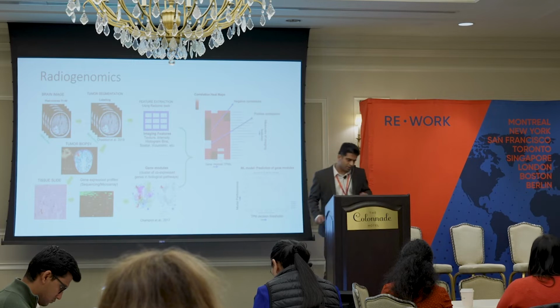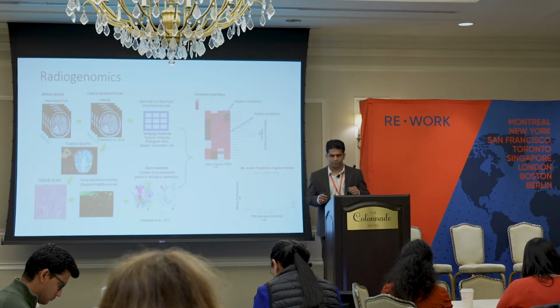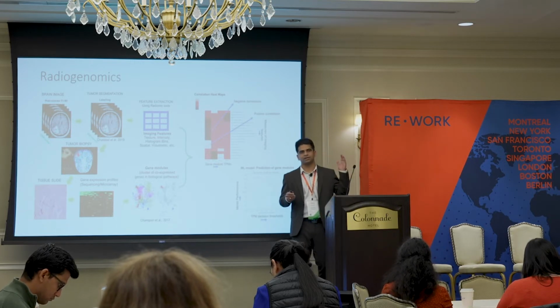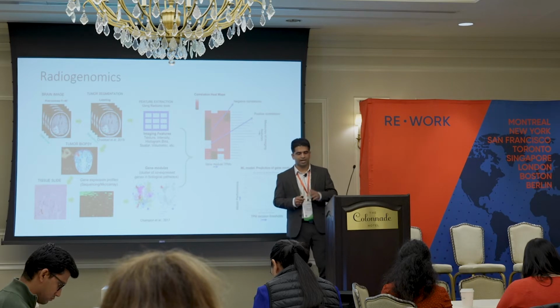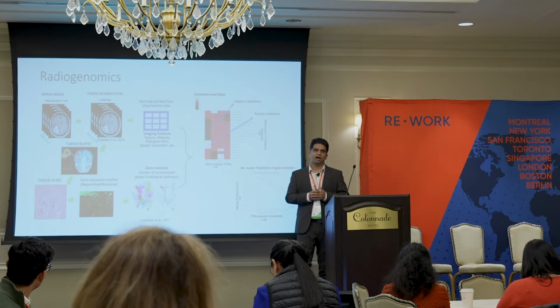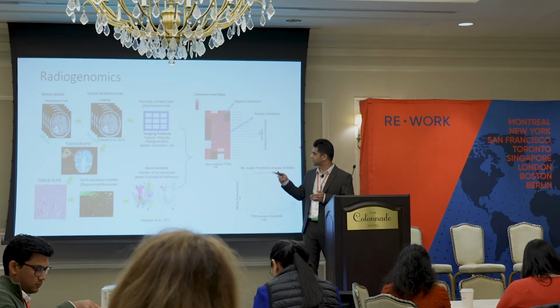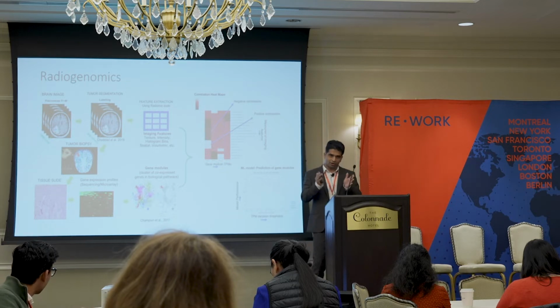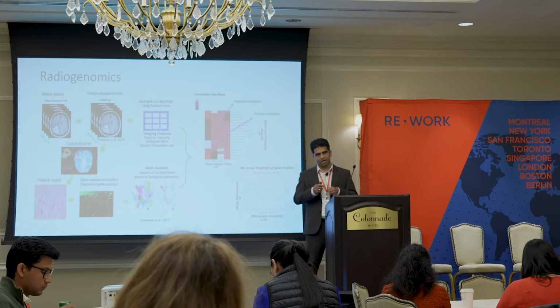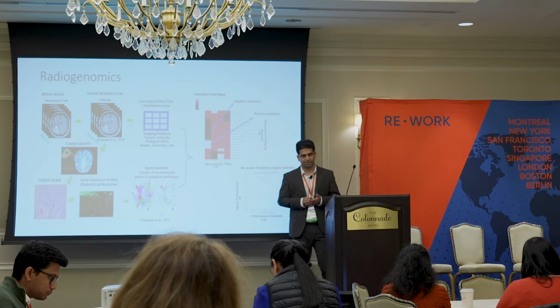So let me introduce the field of radiogenomics. That was the inspiration to develop this software, first of all. It basically starts with patients entering the clinic where they get the MRI imaging done, radiologists segmenting the tumor, which basically gets biopsied and put on tissue slides in pathology, where these tissue slides get stained and you get to know some molecular markers like estrogen and progesterone receptors in breast cancer, for example.